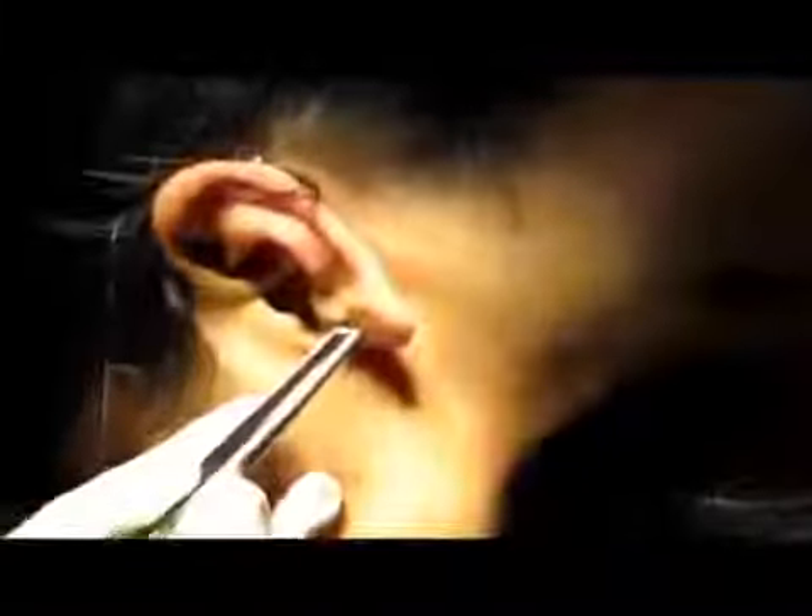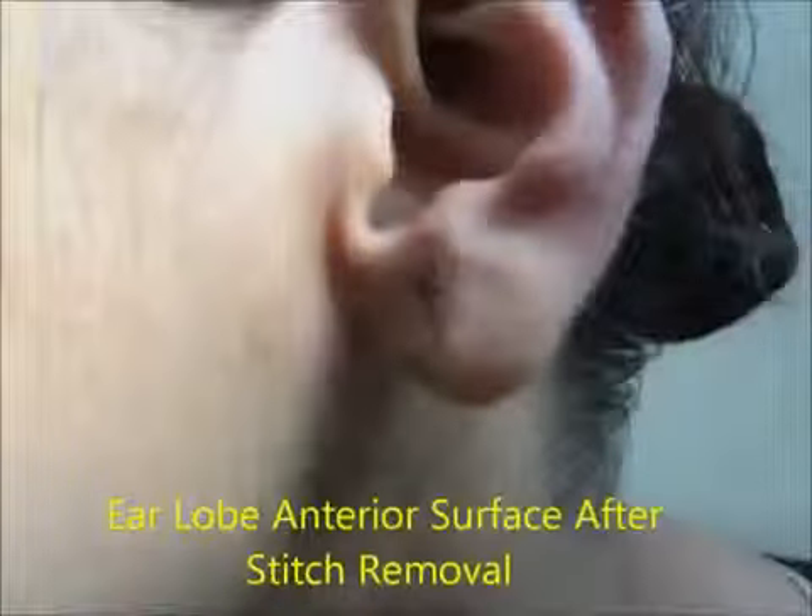This is the technique. After removal of the stitches, I just put adhesive tape for 2 to 3 days for extra protection. You will see I am just finishing the stitch removal. Here one can see the anterior surface after stitch removal, and this is the adhesive tape I have applied.